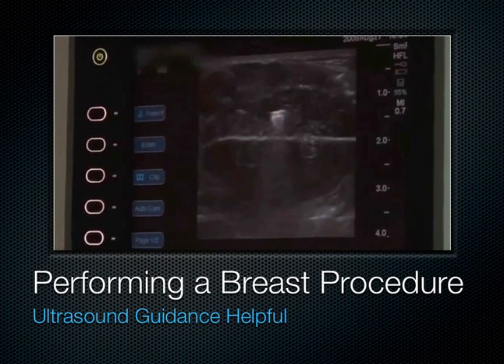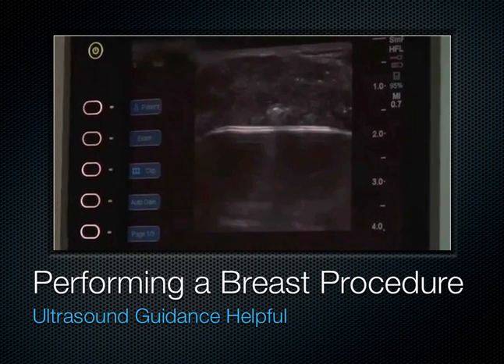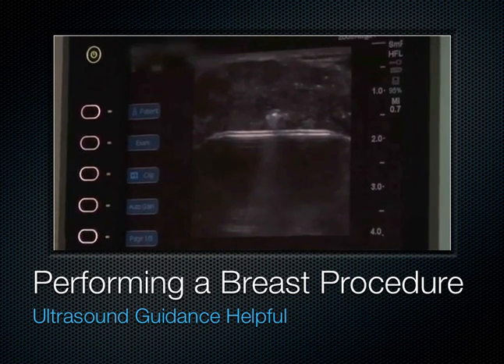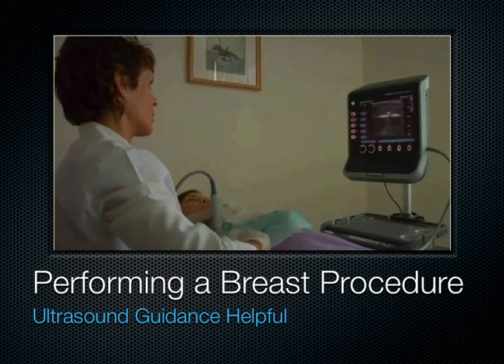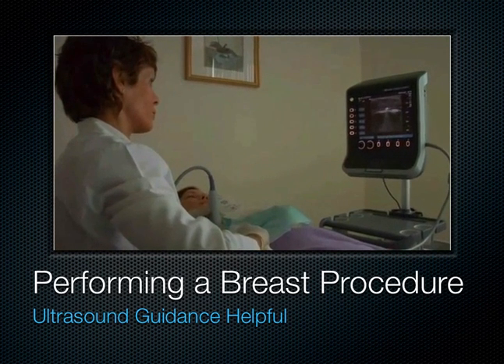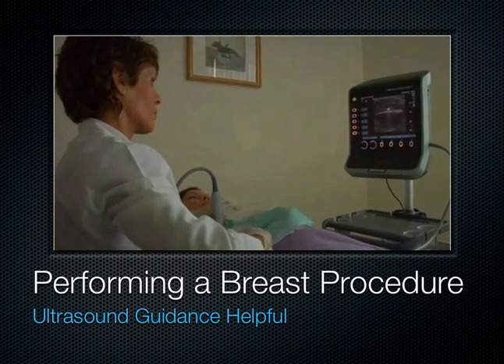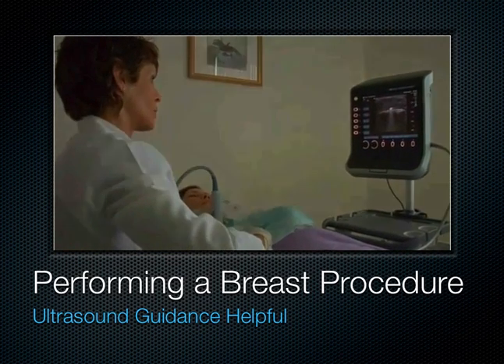So what you'll see if you're watching on the screen, you see the probe there, and you see it starting to get black behind it. That's because the ultrasound waves can't go through the ice. You'll see that double white line get higher and higher and higher, and that's just as it's starting to engulf the whole thing. It sort of eclipses it.